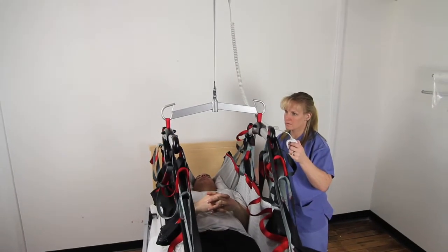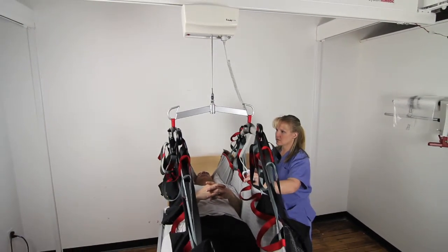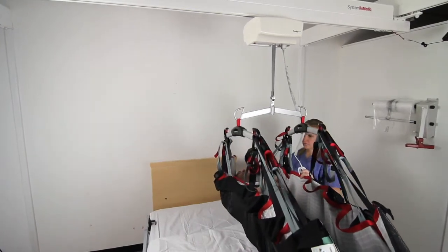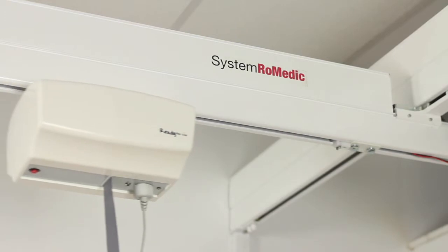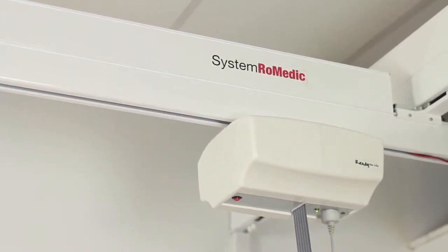RITA is a safe and easy-to-use overhead lift that combines design with well-thought-out and proven functionality. RITA is suitable for use with all types of rails on both permanent rail systems and on portable freestanding lift stands. It is very easy to use, moves silently and gently, and features functions that maximize comfort and security.